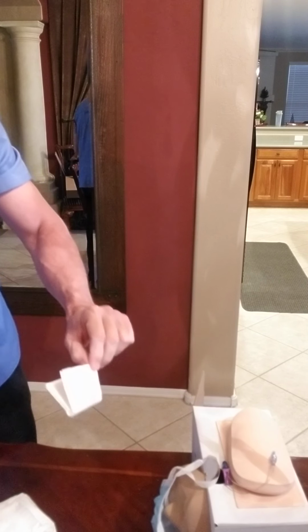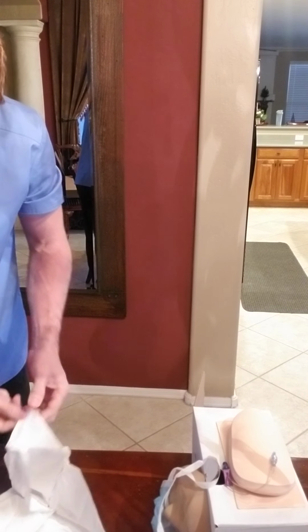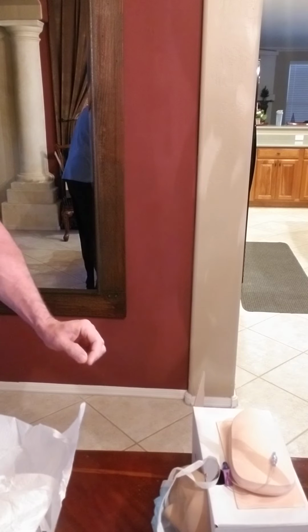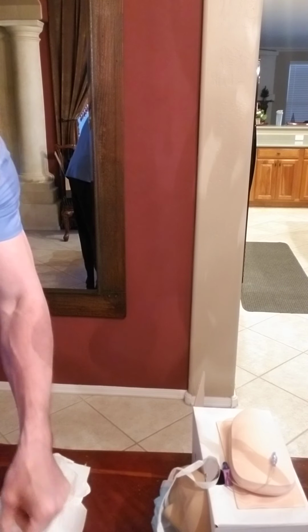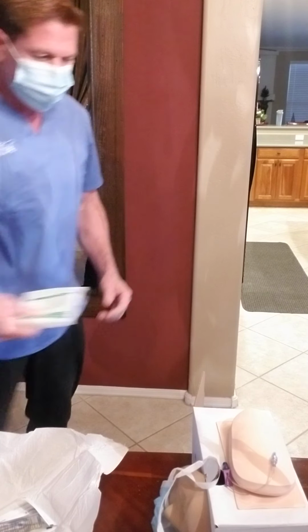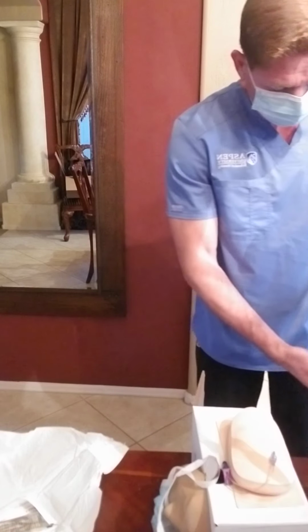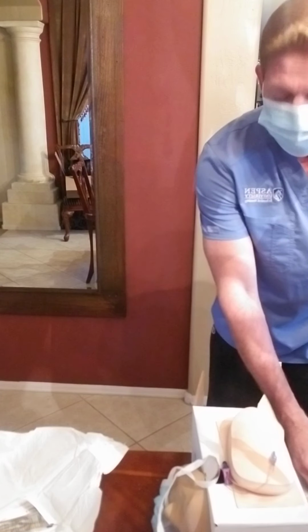These are my gloves, but they don't fit, so I brought my own gloves. So I'm gonna open this. Pulling on the outer 1 inch. And that thing will not stay. I'm not gonna cross the sterile field, but I'm gonna grab my gloves and I'm going to put them on over on this side here, facing the camera so you can see what I'm doing.